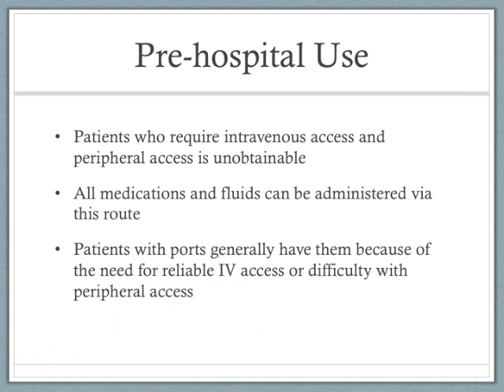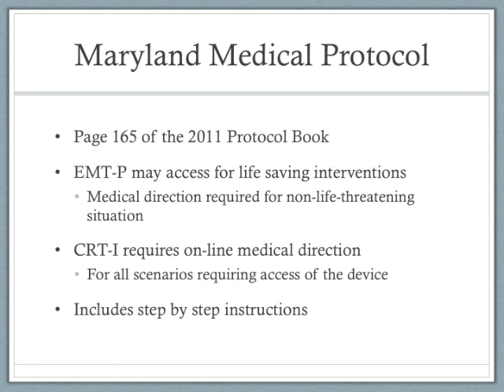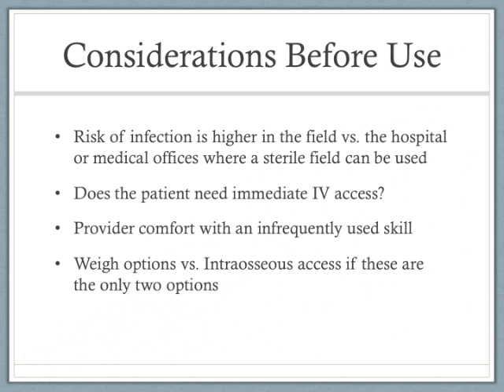Maryland Medical Protocol has guidelines and procedures for accessing central venous access ports on page 165 of the 2011 protocol book. In there it says that paramedics can access this to initiate life-saving interventions without medical direction. Medical direction is required to access a port for non-life-threatening situations. CRTIs, EMTIs require online medical direction for all scenarios requiring access of the device. Included also on that page and subsequent pages are step-by-step instructions on how to access a port.